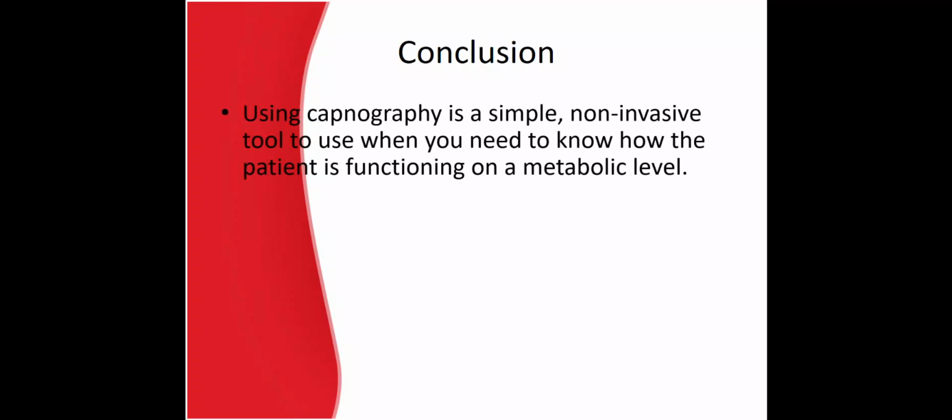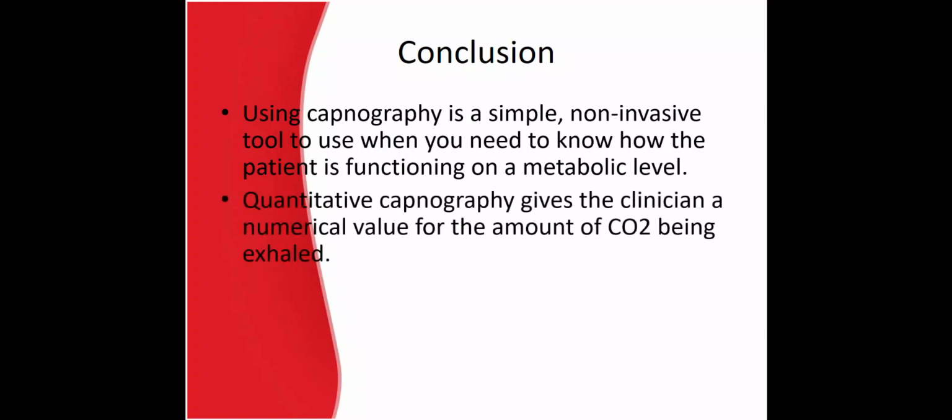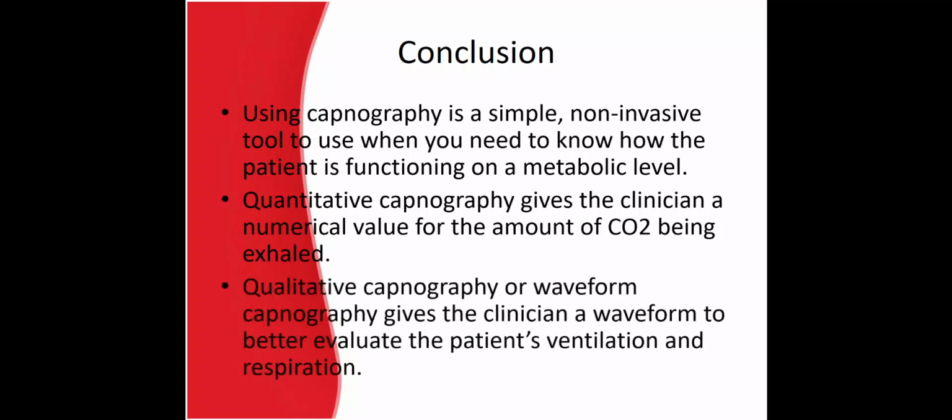In conclusion, using capnography is a simple, non-invasive tool to use when you need to know how the patient is functioning on a metabolic level. Quantitative capnography gives the clinician a numerical value for the amount of CO2 being exhaled. Qualitative capnography, or waveform capnography, gives the clinician a waveform to better evaluate the patient's ventilation and respiration.